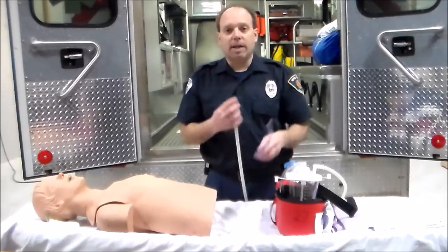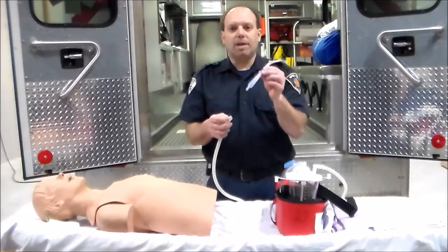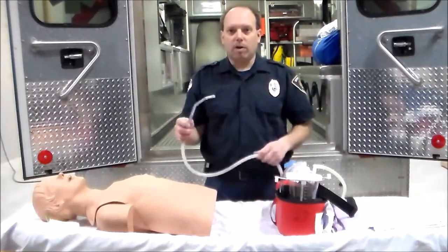For our purposes in this section, because we're dealing primarily with EMT ventilation and airway management, we're going to work with the Yankauer — that hard suction catheter. So we'll place that on, and now we are all set.